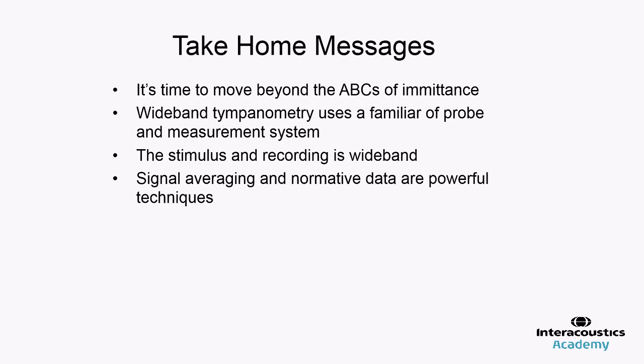So one really powerful addition is that we provide a series of clicks that are averaged to extract them from the noise. And we also have more normative data for wideband reflectance across many different groups than we really have for single frequency tympanometry, like 1,000 hertz tympanometry. So we have developed quite a number of studies across many different groups, and so that really helps us to be able to compare. And I didn't show these data today, but there are a number of studies looking at test-retest reliability, and it's quite high for wideband absorbance in the high frequency region.